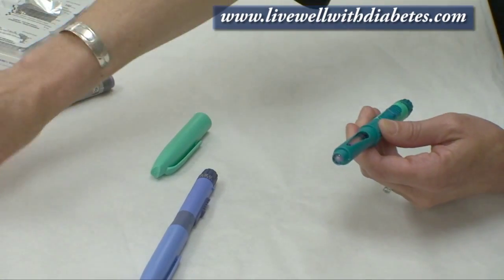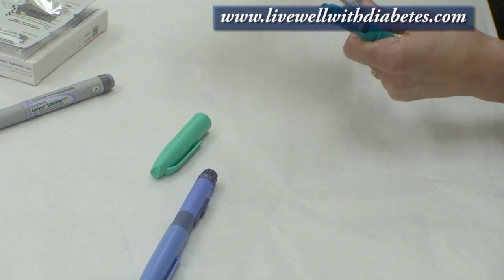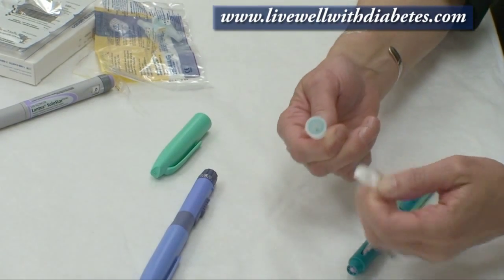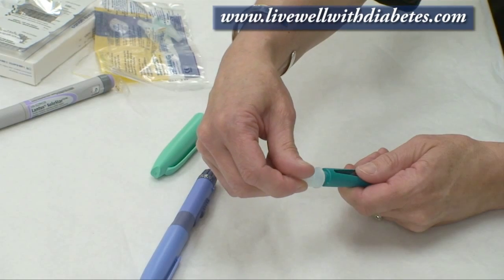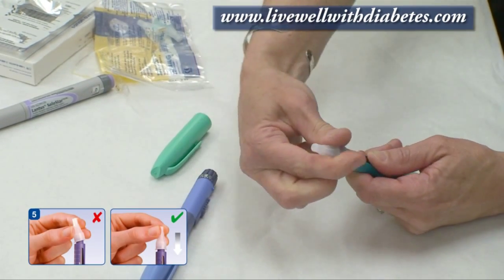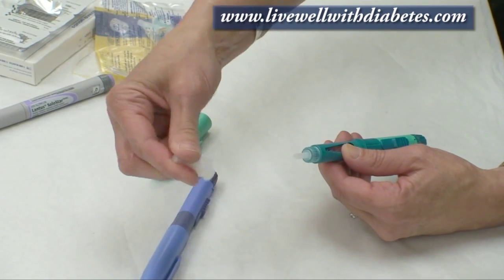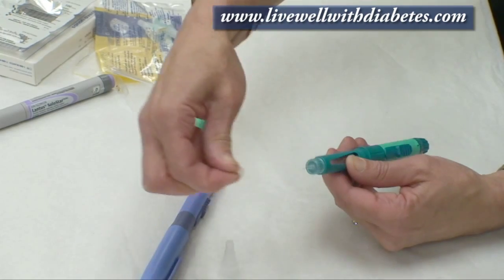If I was going to use this pen for the first time, I take a needle. Each needle comes with a piece of paper on it — I pull the paper off and then screw the needle over top of the pen and turn it on all the way. Each needle comes with two caps: the outside cap I just pull off, and the inside cap I hold on to the tip and pull that off.